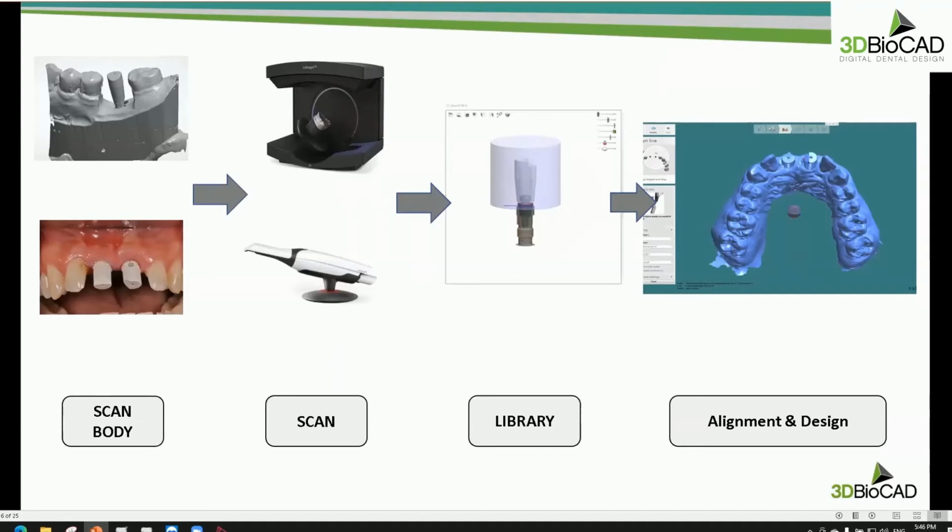Same as like impression coping. With the stone cast workflow, we want to placing on and we use desktop scanner for that. For intraoral way, we place the scan body in the patient's mouth and use intraoral scanner. We do know, yes, on chair side, yes, we do every day. And third thing, what I need to point it is the CAD library.